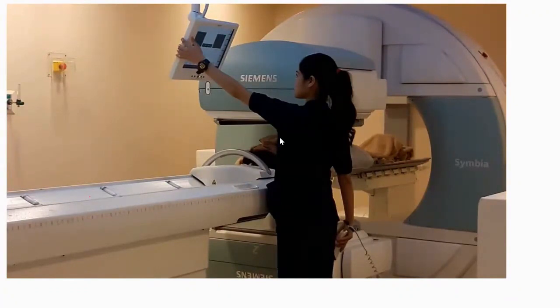What happens in them? It states that the examination of the thyroid will take, for example, 6 million counts, or 5 million counts, or 5,000 kilo counts. For instance, 5 million counts yield an image that is considered accepted. These values can be calculated physically, but if we delve into the details, it can be overwhelming. Firstly, these values are essentially provided by the company itself, which supplies you with fixed protocols.